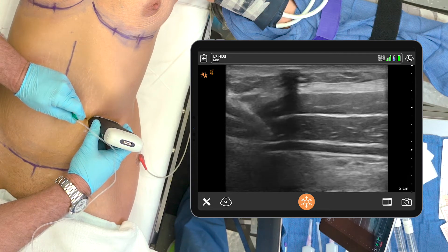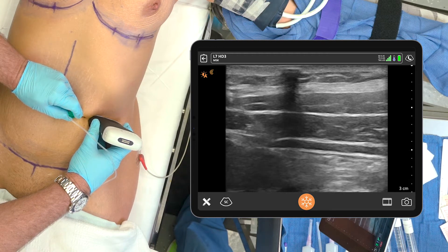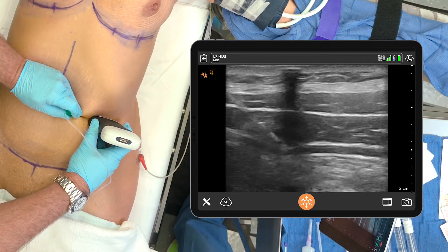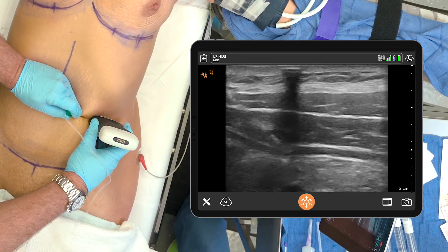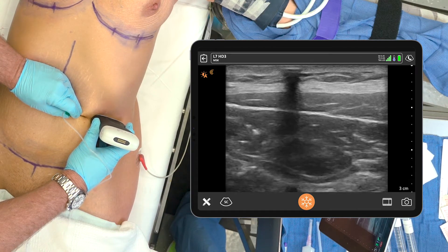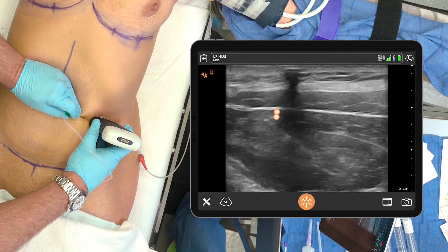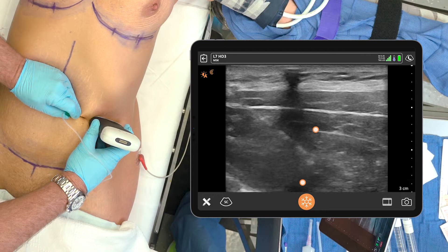Now I'm just following the needle down, and there I popped in. Give me a test dose. There's the space between the two. Switch over to the ropivacaine. And there the muscles are separating right there — that's perfect, exactly what you want to see. You can see the transversalis being pushed down and the internal abdominal oblique being pushed upward, with the Exparel-Marcaine mixture separating the two.